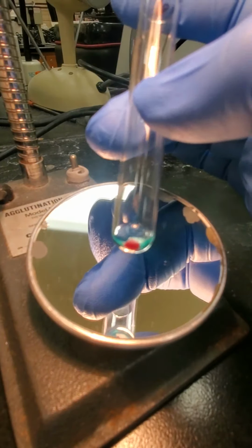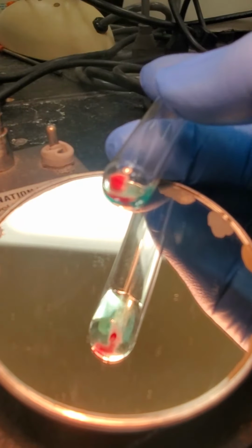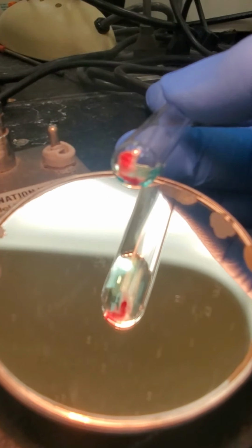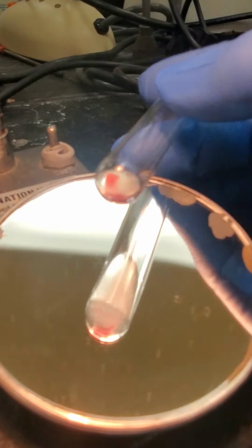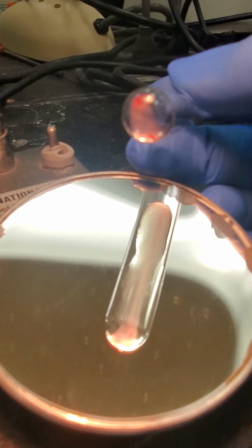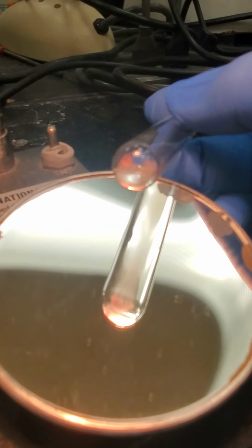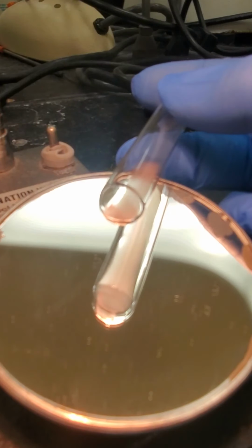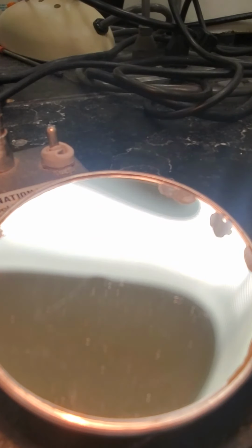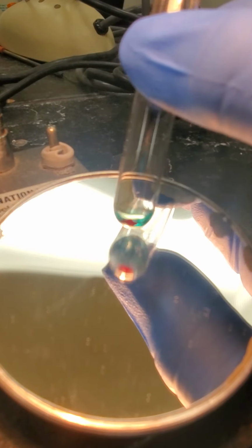Okay, so this is tube 6. So this is like our weak D testing. So this is the AHG read for tube 6. So record this reaction there. Okay. This is our AHG read of tube 10.